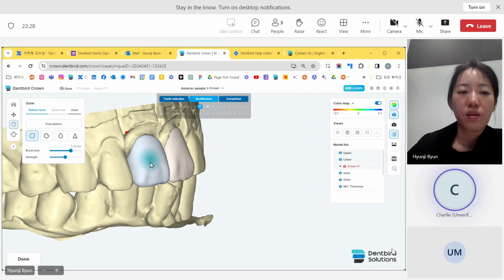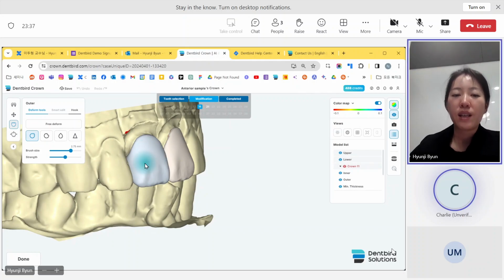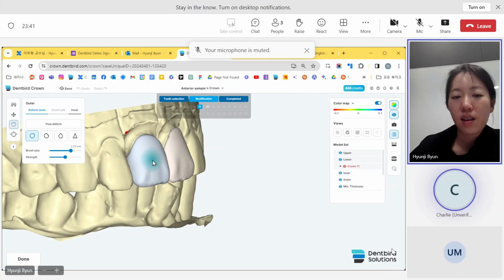I don't have one right now, but maybe I can try to get one, not today, maybe a few days later. Is it okay? Why do you not have any today? Because normally our taste is perfect. Even when we scan with our scanner, we don't have one.